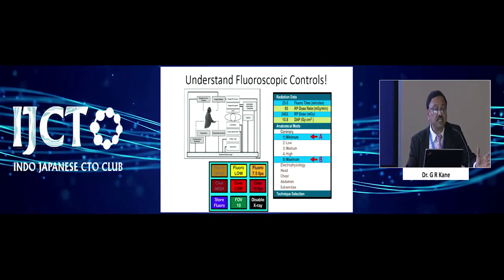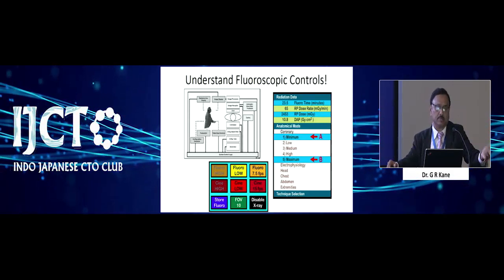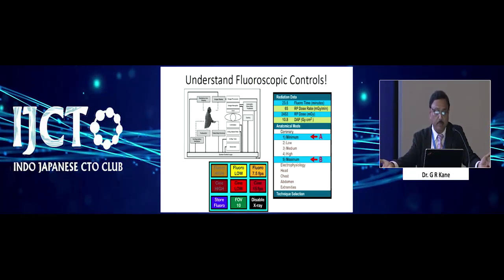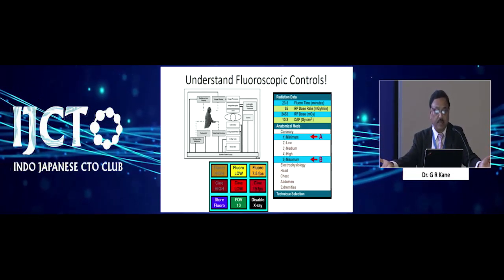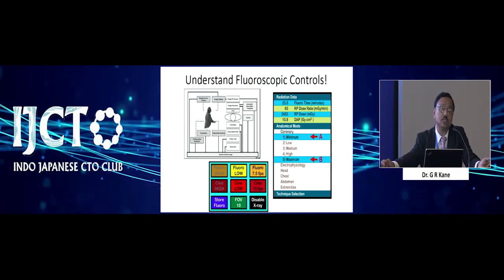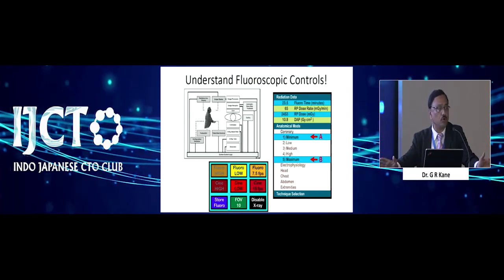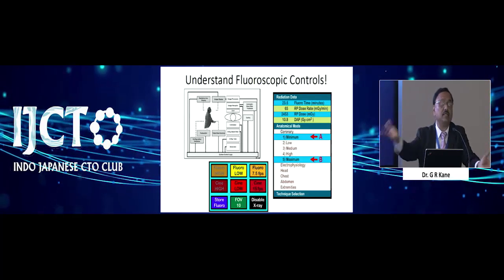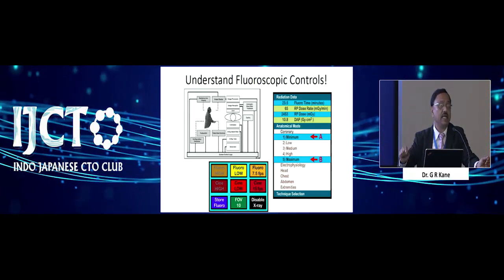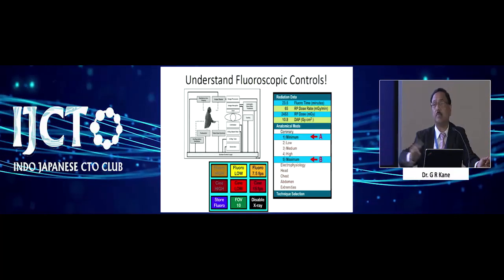The modern machines give you a lot of good things by which you can reduce the patient dose and subsequently your own dose. You have the fluoro time, you have the fluoro speed, 7.5 frames, 15 frames, 30 frames, and you have fluoro and cine. Whenever you do a CTO especially, it is now mandatory that you do the majority of your procedure under fluoro, with fluoro store and rewind the fluoro and see it. Use cine as little as possible, because every time you press the cine, your radiation can be 10 to 60 times more compared to the fluoro.